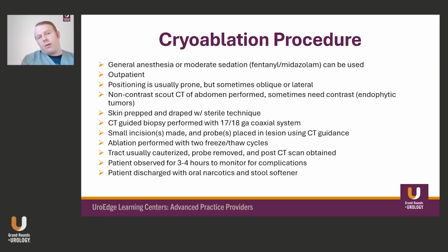So we do the biopsy, and then we pull the biopsy needle out. Then we use a cryoablation probe. There's about 3 or 4 on the market currently. I use one specific company that I tended to train on. This one uses 2 freeze-thaw cycles.